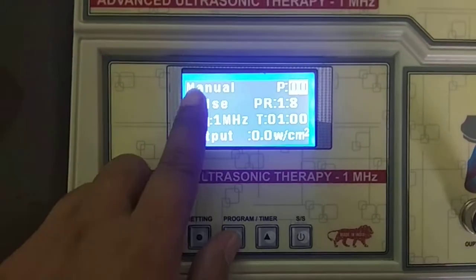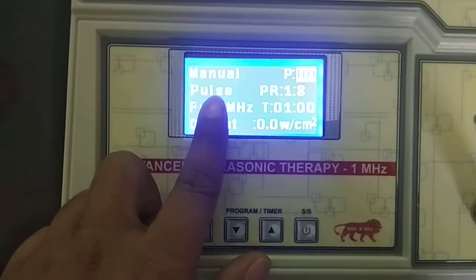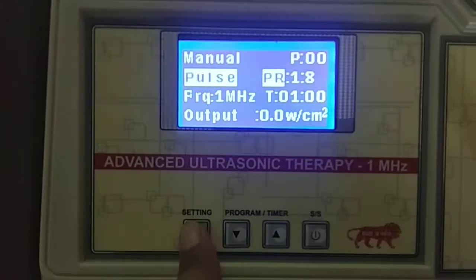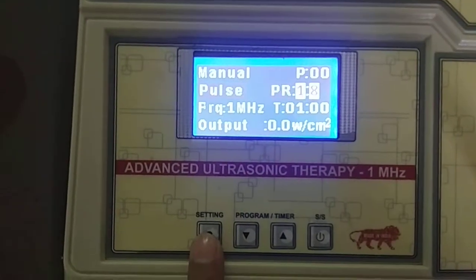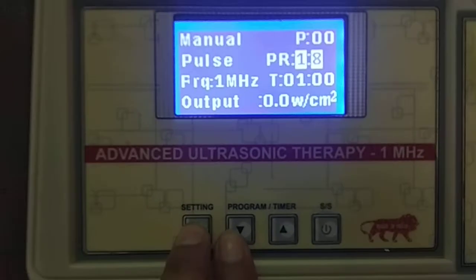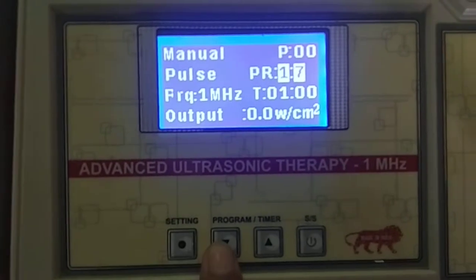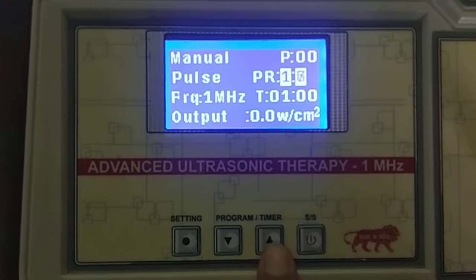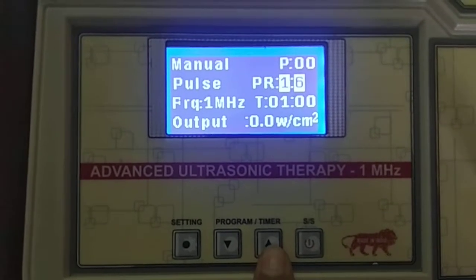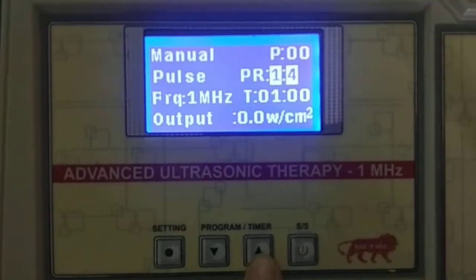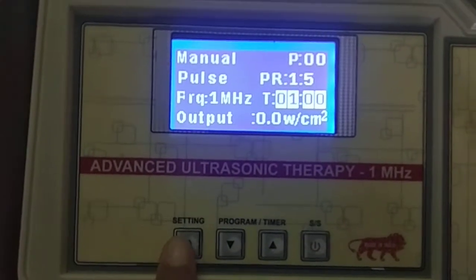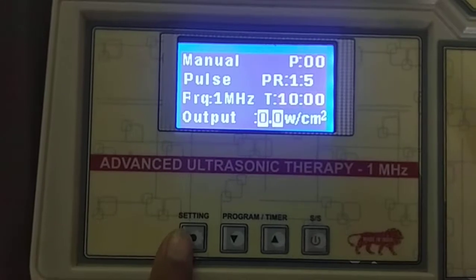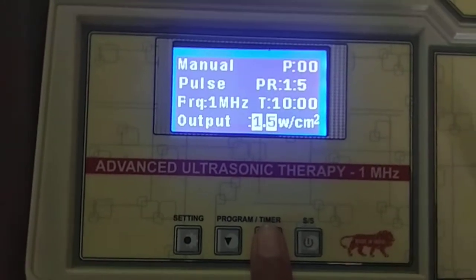Now I am coming to Manual mode. In Manual mode there are two modes: Pulse mode and Continuous mode. In Pulse mode, you have to choose the Pulse ratio as well. You can see values of 1.8, 1.7, 1.5 — it is decreasing and this increases. I am choosing Pulse ratio 1.5, treatment time 10 minutes, and output 1.5 Watt.